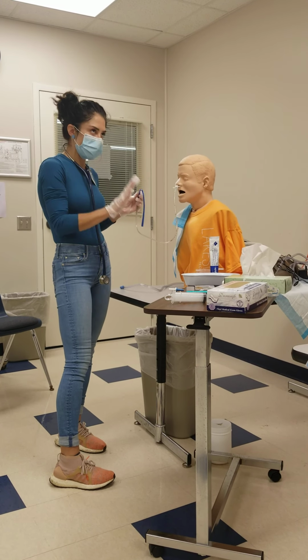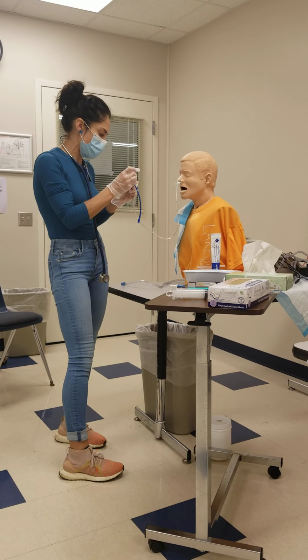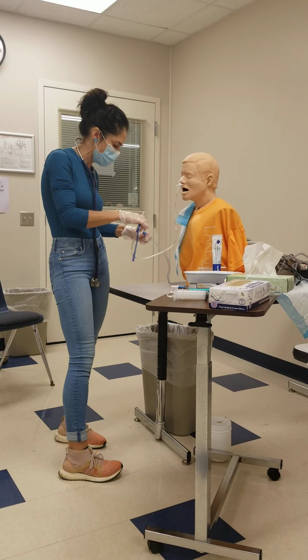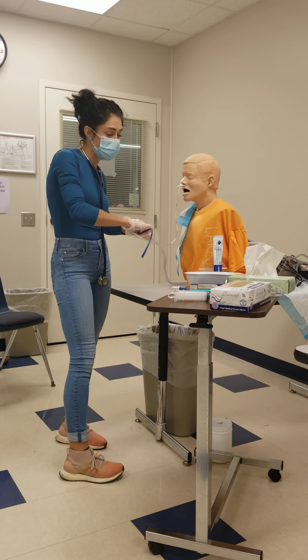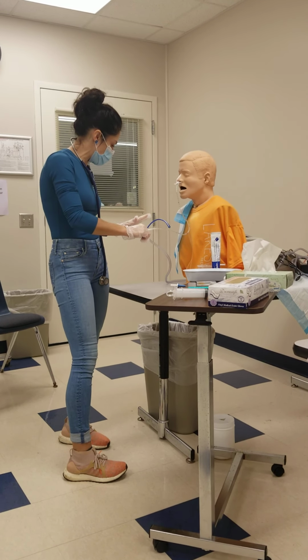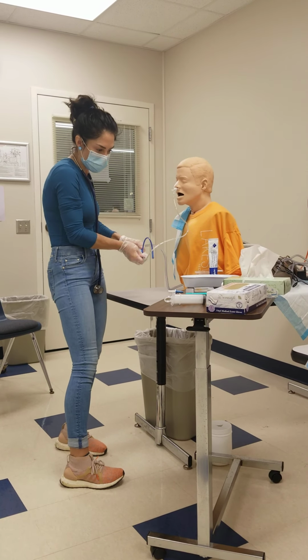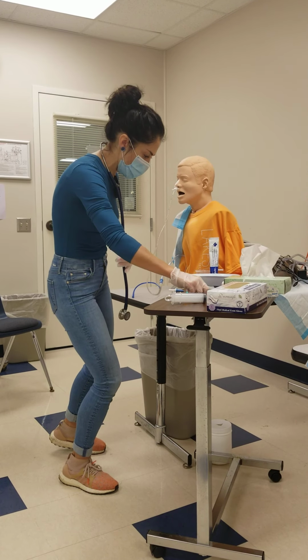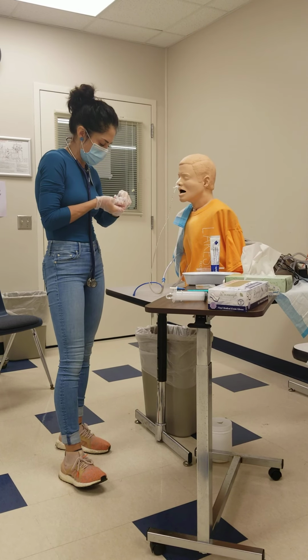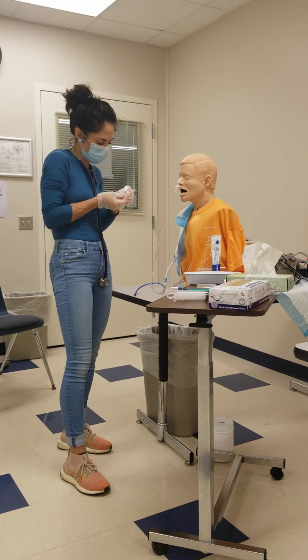And if it seemed like I'm in the right place, but I'm not getting any return, even though the pH says so, then I would continue going 2 inches further. Okay, so after I've confirmed my placement, I'm going to put it on intermittent suction. So I have my connector here. Okay, we've got that. And then I'm going to secure the tube, if I can get this tape open.